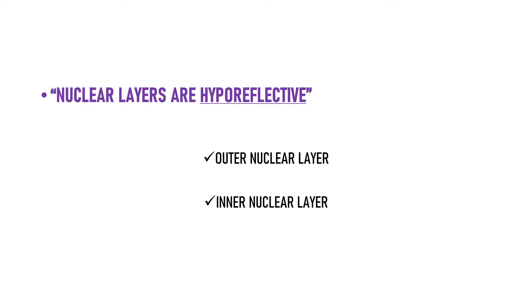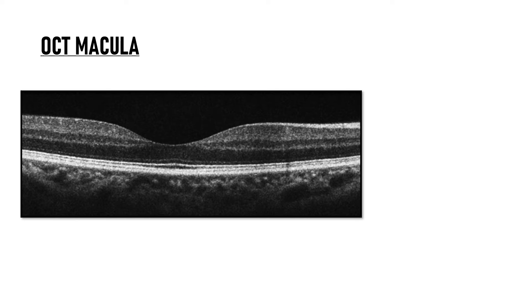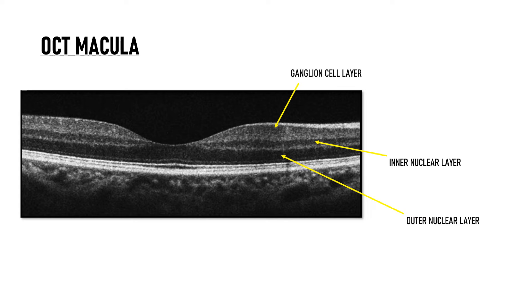The one thing that will help you easily and quickly identify the layers of retina is to remember that the nuclear layers are hypo-reflective on OCT scan. So what are the three nuclear layers of retina? The outer nuclear layer, the inner nuclear layer, and the ganglion cell layer. Moving from outside to inside, the first hypo-reflective layer is the outer nuclear layer, the next is the inner nuclear layer, and the third is the ganglion cell layer.